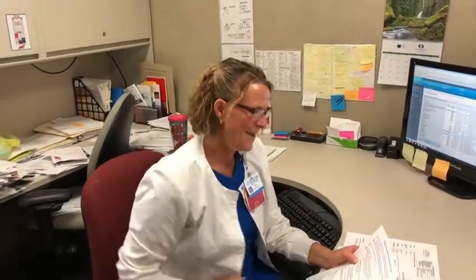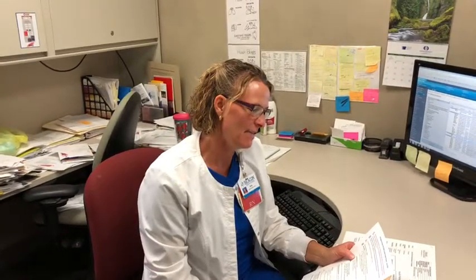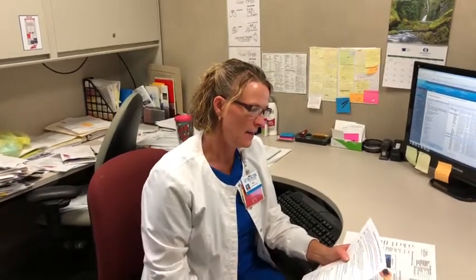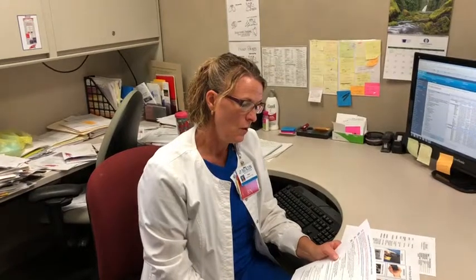That's a mouthful. All right, number 2 contraindication is if they have impaired cognition or judgment, or if they have a high suicide risk or attempted suicide. And finally, if they're unable to physically manage the pump.